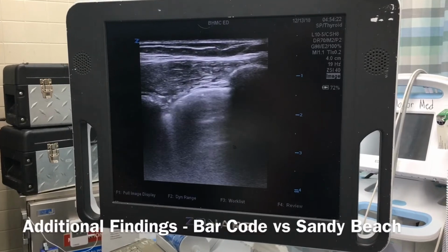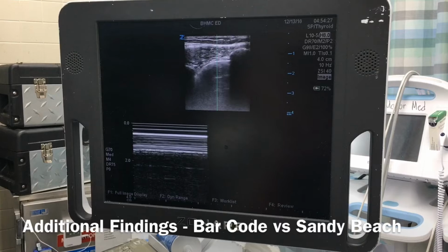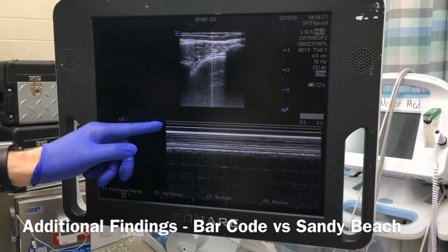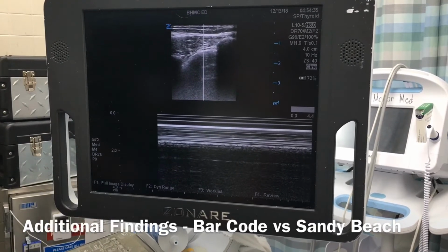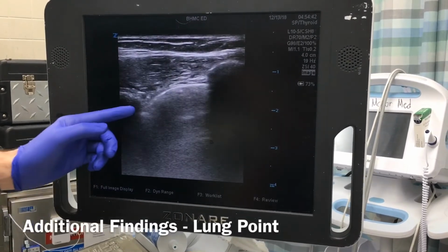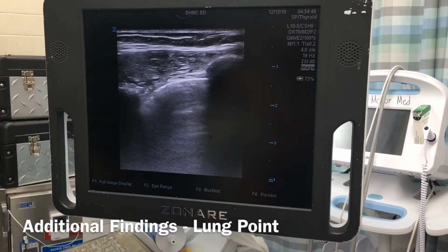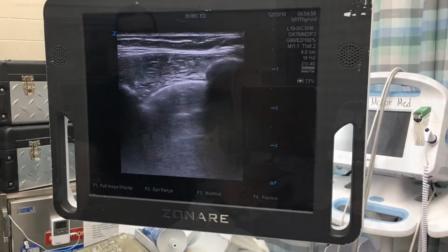The other thing you can do is put on M mode, and you want the line to go directly through the pleura. And the thing we're looking for is what's called the sandy beach, what looks like waves crashing on a beach, which means that you do not have a pneumothorax. Other things that you can look for is something called a lung point, where you have a piece of the lung that will not be moving, and then a piece of the lung that will be moving, and that is 100% specific for a pneumothorax.